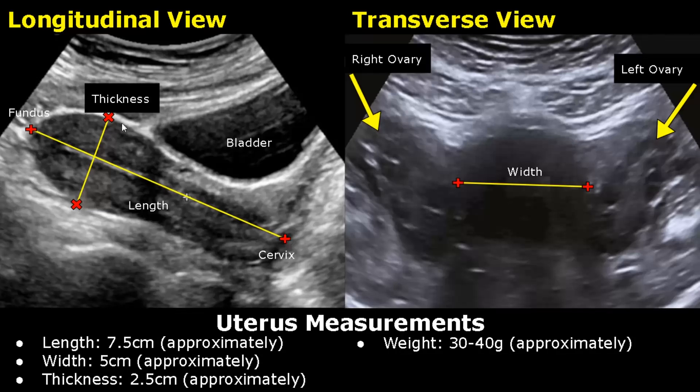The length of the uterus is around 7.5 cm approximately. The thickness is around 2.5 cm.